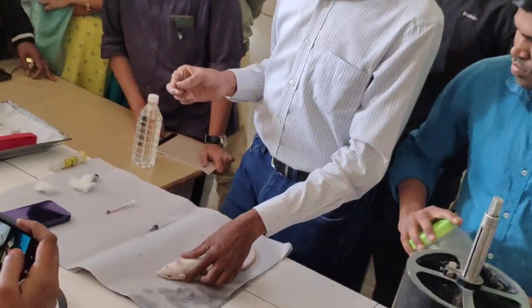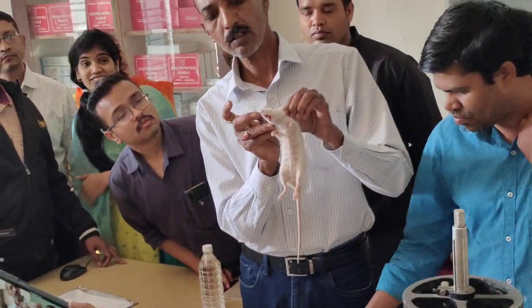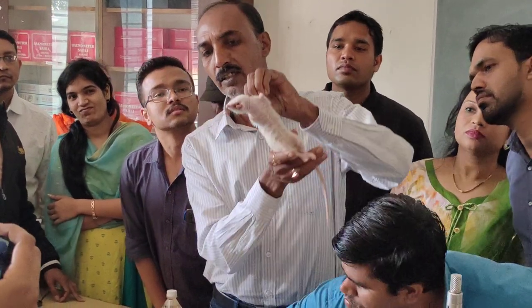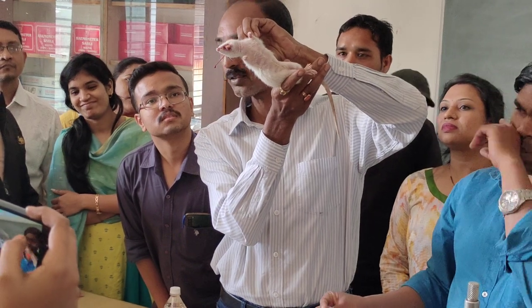See, now the animal has been anesthetized properly. This is the corner we are inserting. See how the blood is coming. This is the retroorbital plexus.